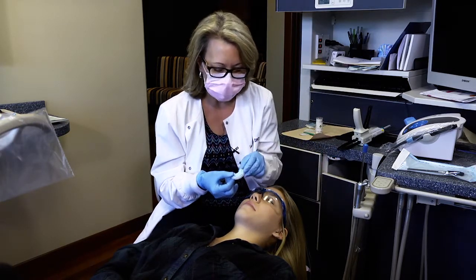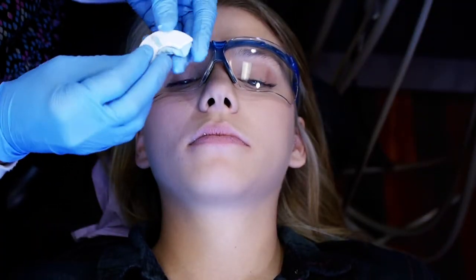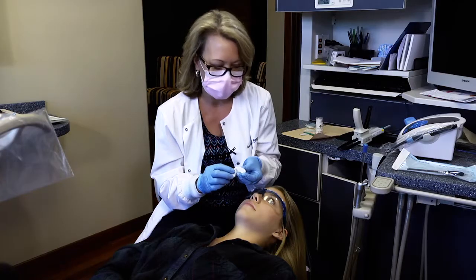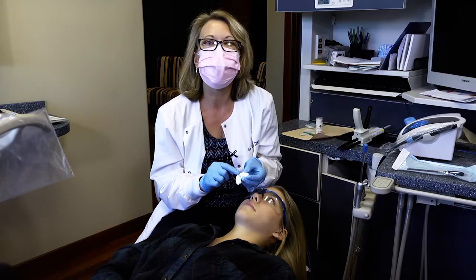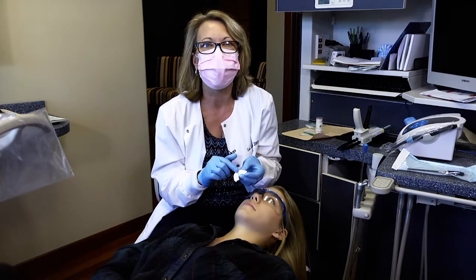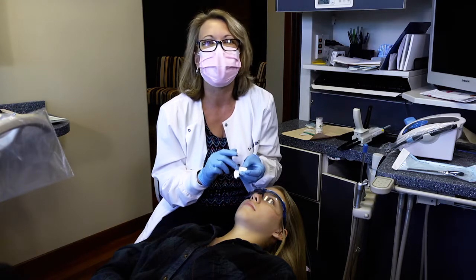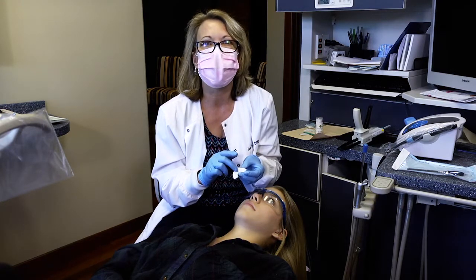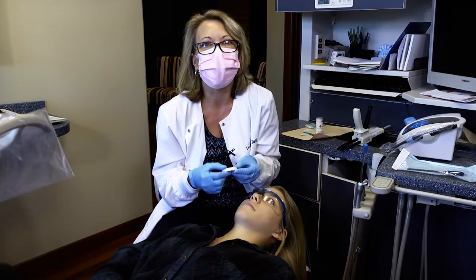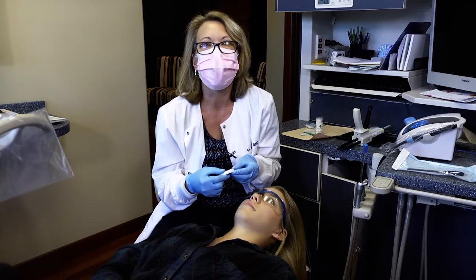And the next thing for me is I'm going to trim off the excess material on the QuickSplint. I don't want to carve it out of the areas that are designed for retention, but I do want to trim this material back so that when Jenna moves her bottom teeth around, she goes into her excursives, she's not actually getting stuck on the bite registration. It's not creating any rough spots for her to guide over. And we simply do that with a disposable Bard-Parker blade. And then we're going to come back and give this to Jenna with some quick instructions.